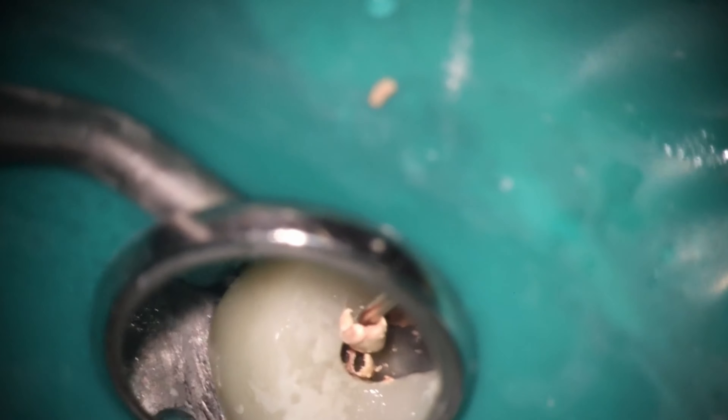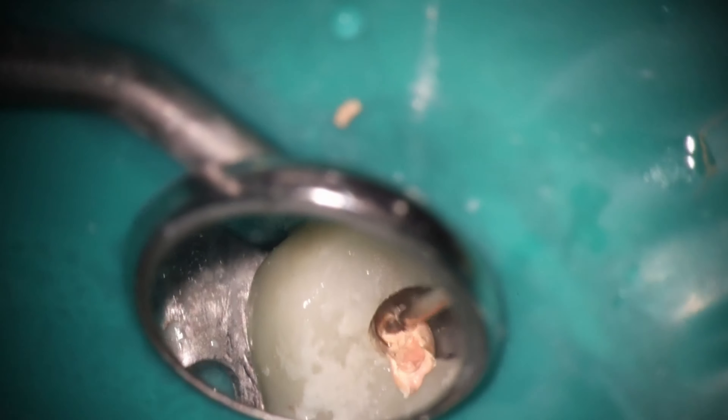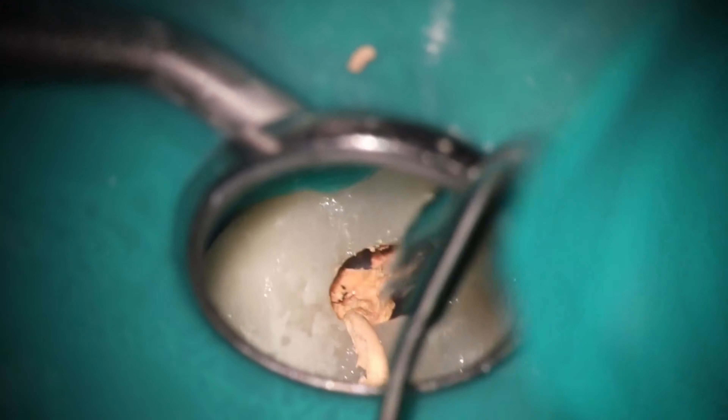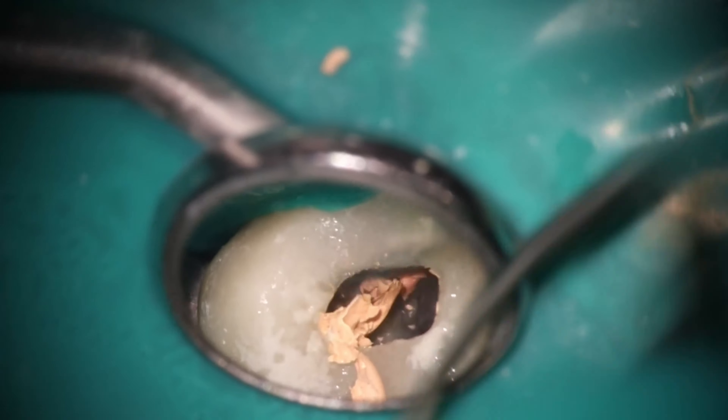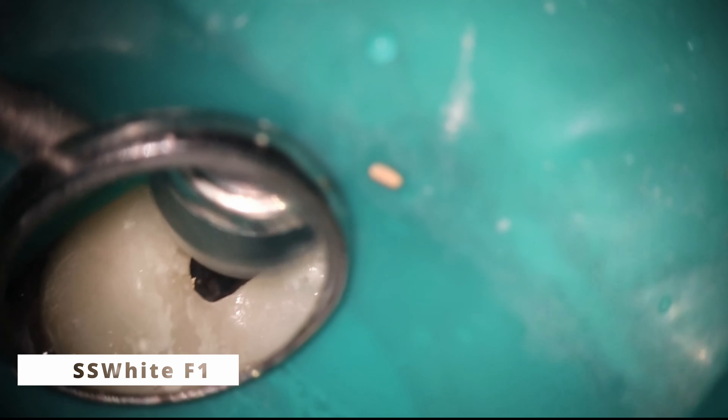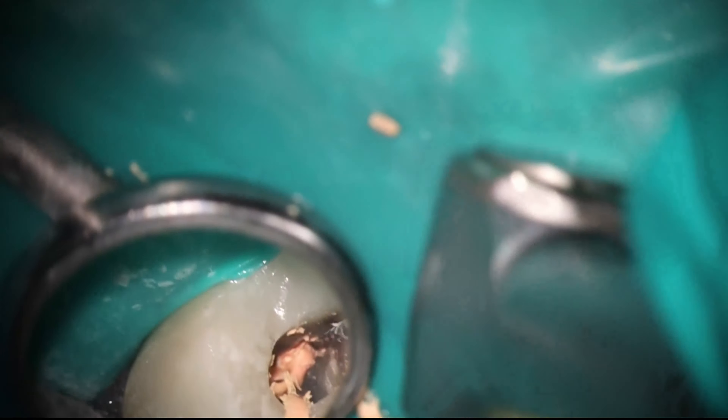Coming in now to start removing the gutta percha — this is just my way of getting that coronal aspect out so that my rotary files don't have to do nearly as much work. Use a heated instrument to remove the bulk of it rather than going straight in with a bur. This is one of my first tests to see if I'm going to need solvent, chloroform, or anything like that to soften it. If the heated tip at 230°C melts it efficiently, it's generally not a problem. You can see that F1 spinning at 500–550 RPM makes quick work of that soft gutta percha.